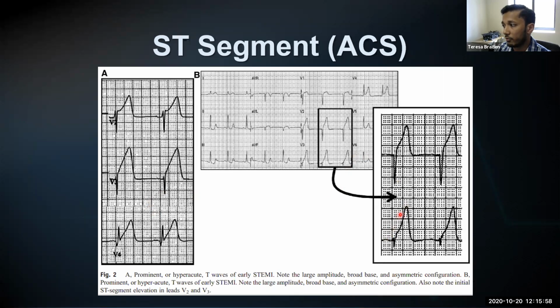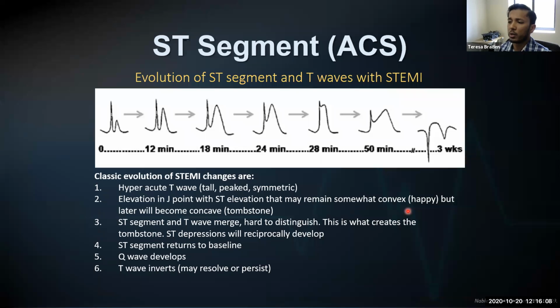And just know that if you have any suspicion, especially here, you can see the ST segment started to get some combination with a T wave as well. So that peaked T wave brought that segment up. But it's really important, I would say, to know what the boards like to test you on, and because it's clinically relevant, this progression that you should see.